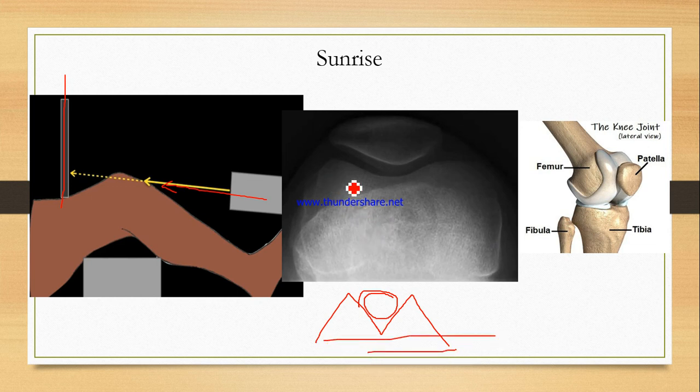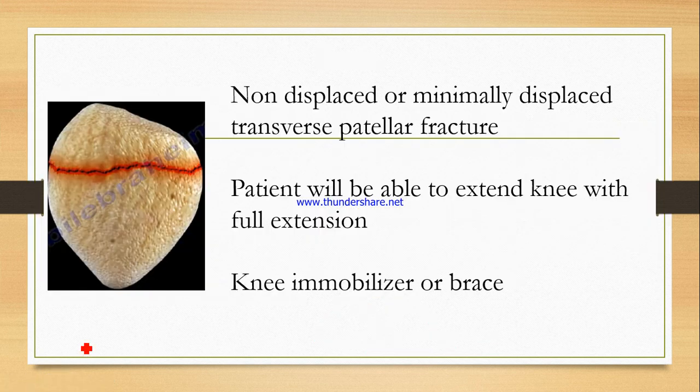In this, you see this is basically the femur, and the patella is rising similar to a sunrise. So this is called the sunrise view.